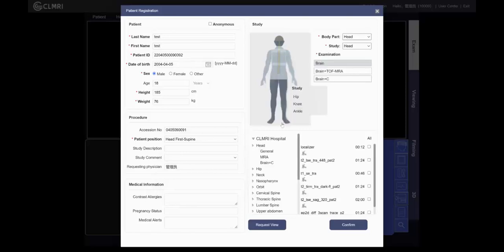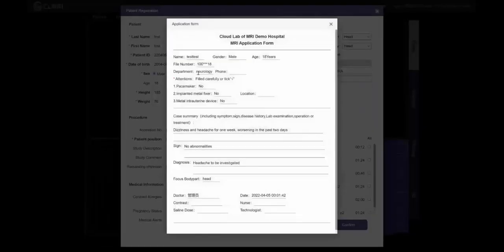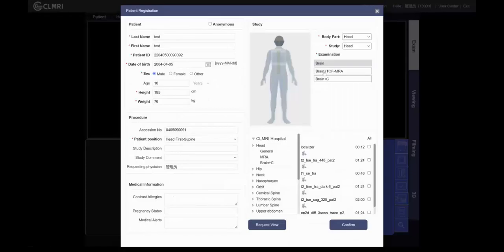We select brain. You can also select the body part from the dropdown: head, then the study: head, then the examination. Click 'Request View' and we can see the application form showing what the patient's problem is — dizziness and headache for one week. The focus body part and examination is the head. Confirm and select all sequences.